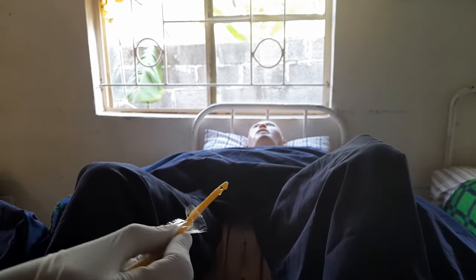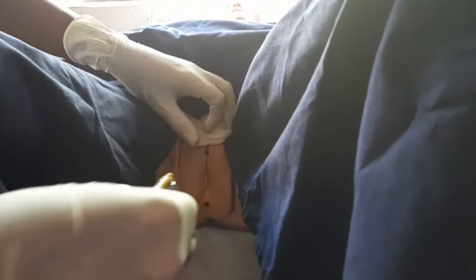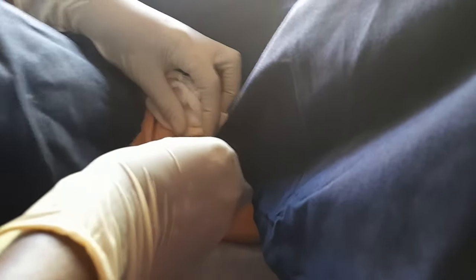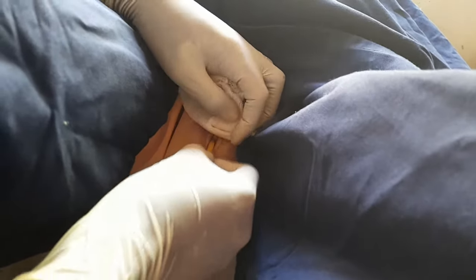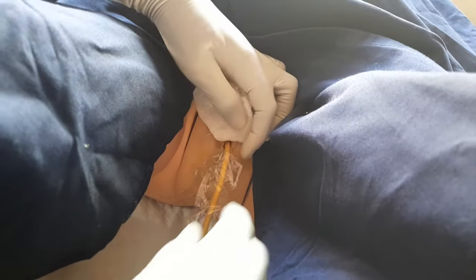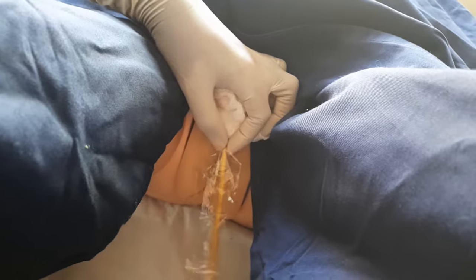Get the catheter — the end with KY jelly is the one going into the urethra. You can use gauze to help open up the area without contaminating. The urethra is here; the vagina is below it, and the anus is further down. Open up a little bit and push the catheter into the urethra. For women the urethra is short — pushing about 10 centimeters, or even five, you'll be able to see urine. Once you see urine coming out and collecting in the plastic sleeve, that's enough.